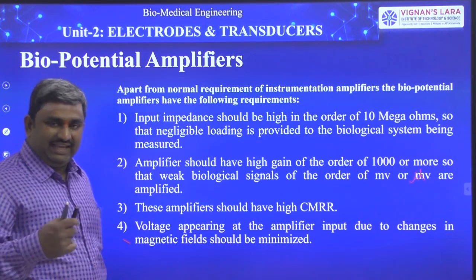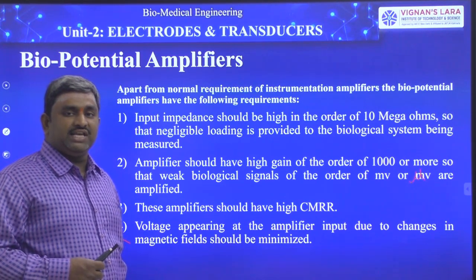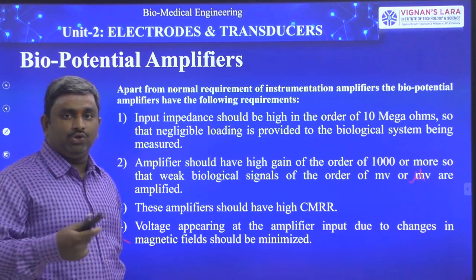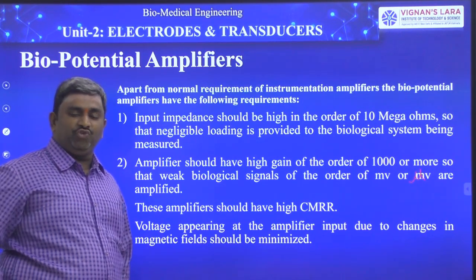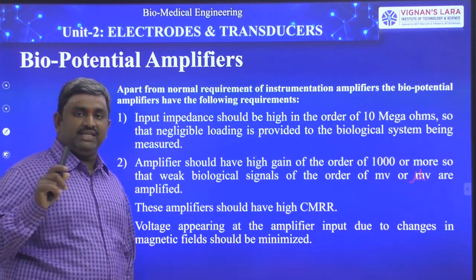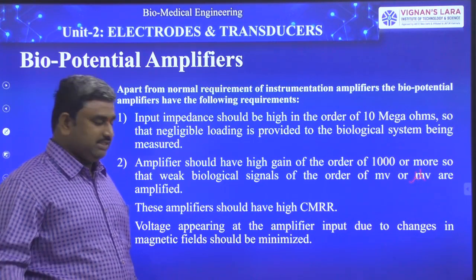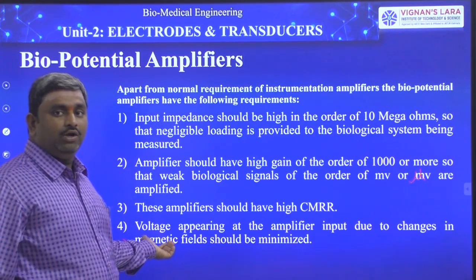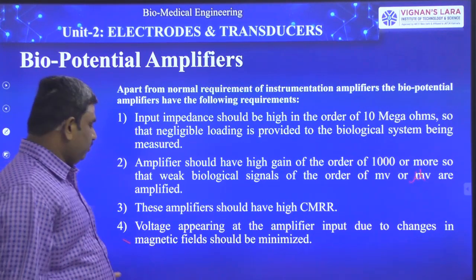When you are taking bioelectric potentials from the human body, in the surrounding places we have to remove any magnetic fields. That is very important to get perfect measurements.